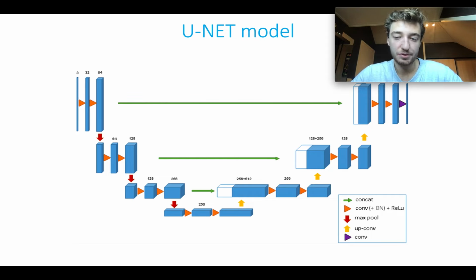So after two convolutions, it does a max pool. This has to be done because otherwise you're going to get problems with the memory of your GPU, and the max pool basically pulls out the highest valuable data of your previous feature map, and also decreases your dimensionality. So from 512 we're going down to 256. And then it's going to repeat this process over and over.